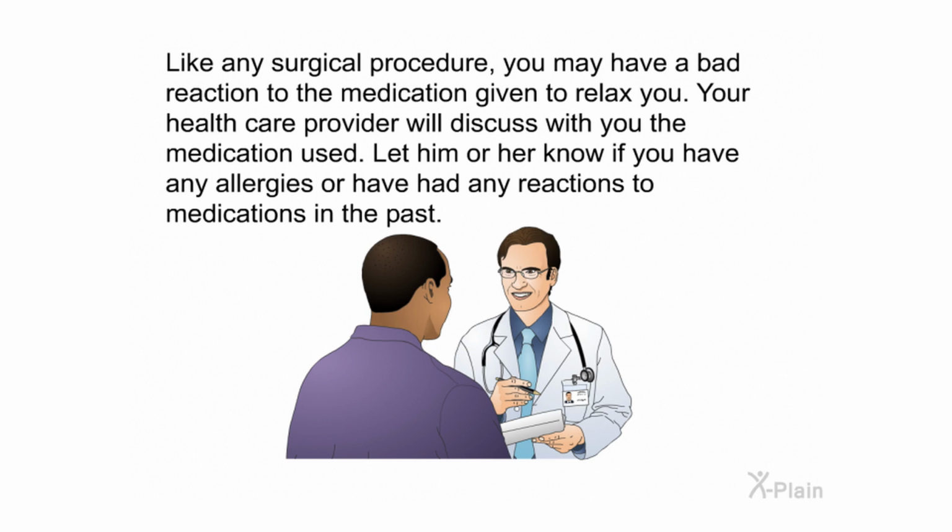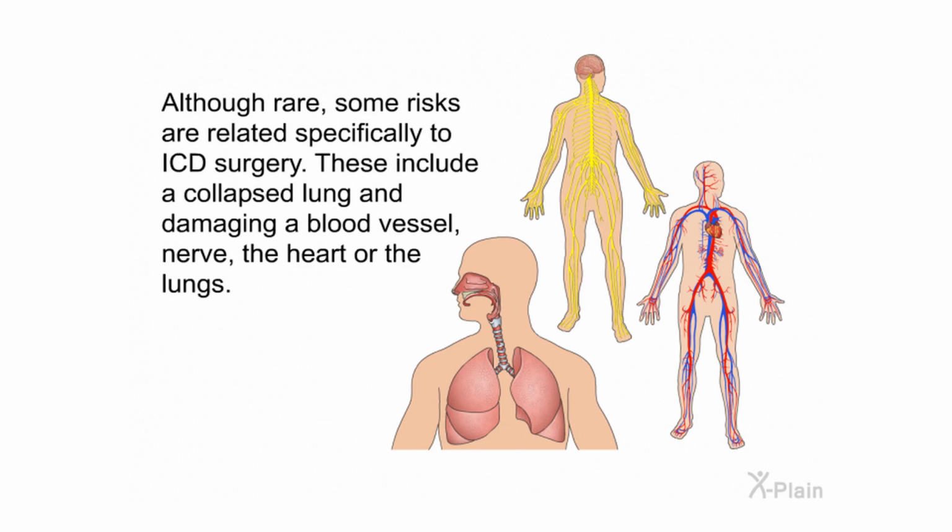Like any surgical procedure, you may have a bad reaction to the medication given to relax you. Your healthcare provider will discuss with you the medication used. Let him or her know if you have any allergies or have had any reactions to medications in the past. Although rare, some risks are related specifically to ICD surgery. These include a collapsed lung and damaging a blood vessel, nerve, the heart, or the lungs.